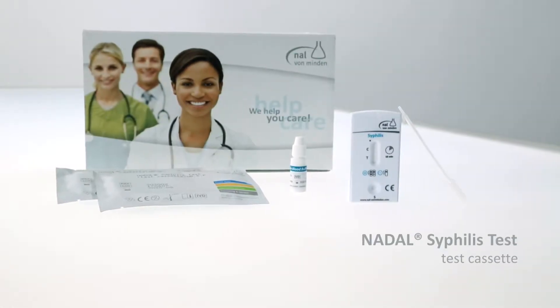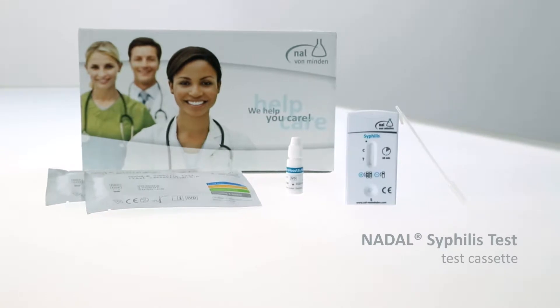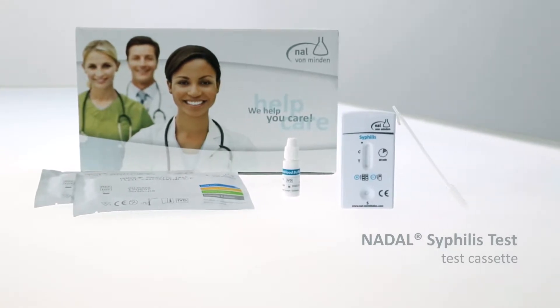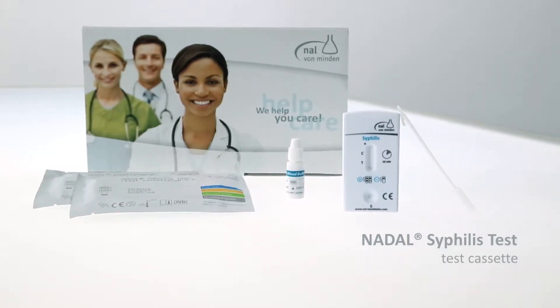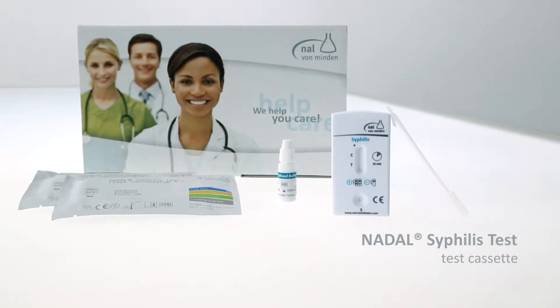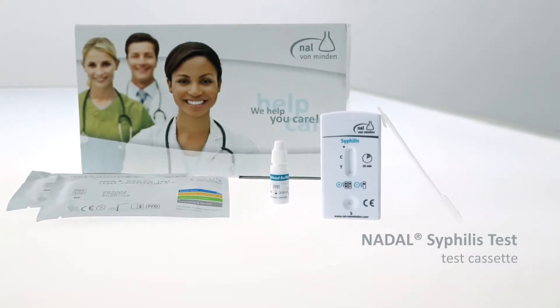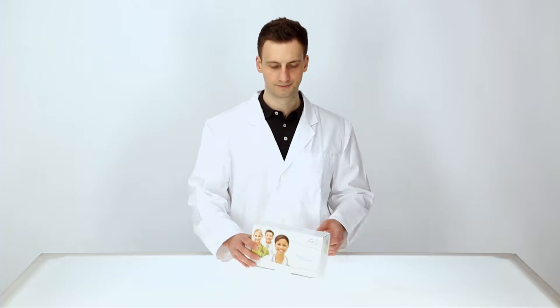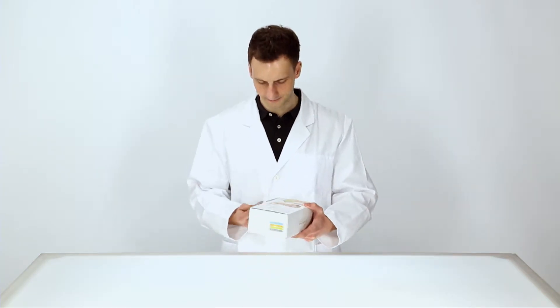The Nadal syphilis test is intended for use in the qualitative, presumptive detection of IgM and IgG antibodies against treponema pallidum in human whole blood, serum, or plasma samples. The test serves as an aid in the diagnosis of syphilis.